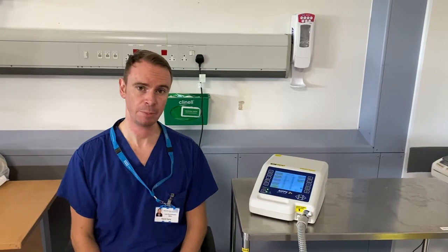Hi, I'm David Erie. I'm the Lead Physiotherapist for the Northwest Ventilation Service here at Wythenshawe Hospital. I'm going to talk you through the NIPPy 3 Plus today.